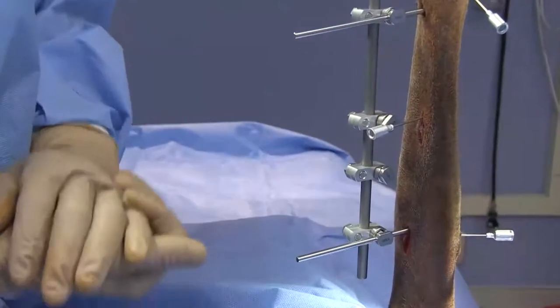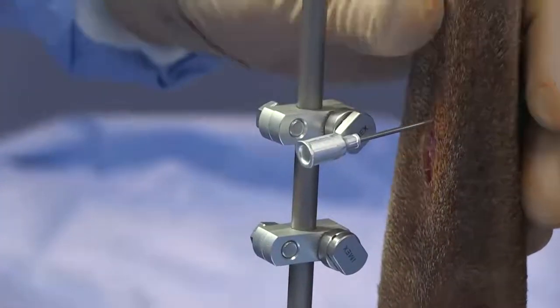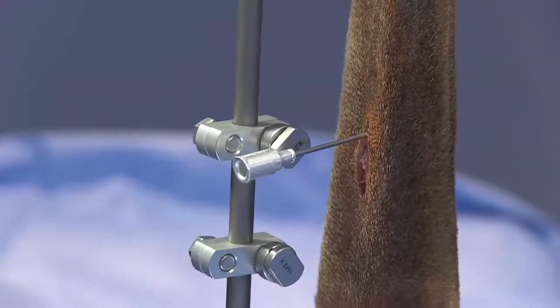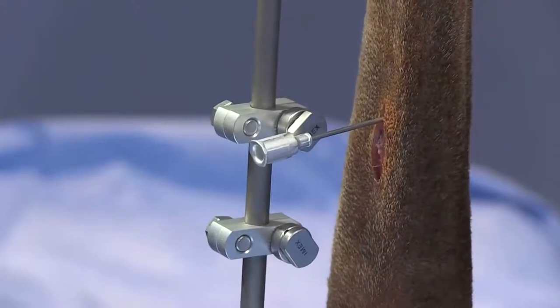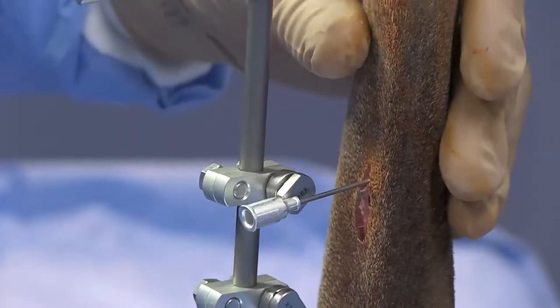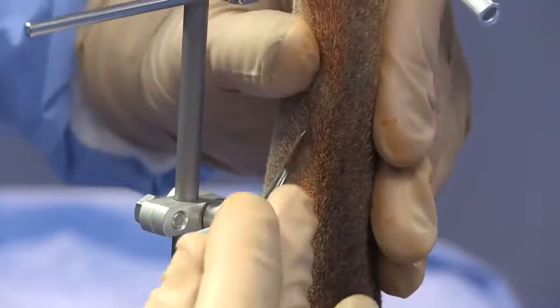The optimal placement of the next pins is just adjacent to the fracture site — but not too close, because we don't want to go into the fracture. We also want to be cognizant of the possibility of fissuring adjacent to the fracture site. A general rule of thumb is about a centimeter or so just off that fracture site.